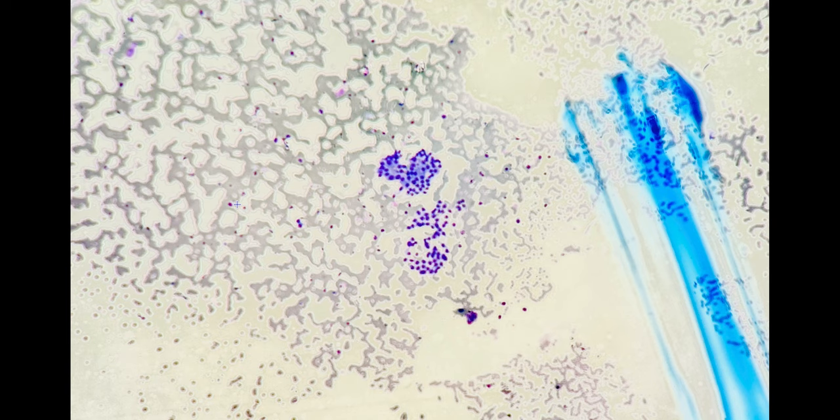Okay. Now let's talk about the thyroid. This is using the Bethesda classification system. And there are six categories. There's one, non-diagnostic or unsat. And this is when you have cyst fluid only or virtually acellular. And the management will be repeat FNA with ultrasound.